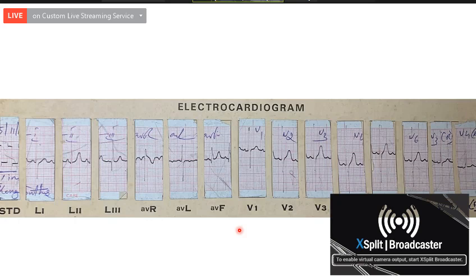Okay. Whenever you see this type of large equiphasic deflections in the mid-precordial leads, what is that phenomenon known as? Katz-Wachtel phenomenon. What is the criteria for diagnosing biventricular hypertrophy based on the Katz-Wachtel phenomenon? More than 50 millimeter amplitude. More than 45. The R and S put together should be equal to or more than 45. Here it is just short of that, but for all practical purposes, we can take it as a Katz-Wachtel phenomenon.